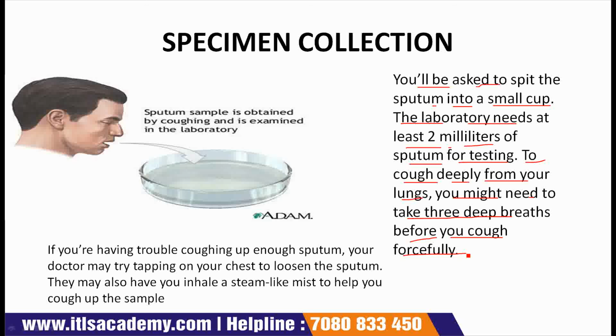Your doctor may ask you to rinse out your mouth with clear water to help get rid of any other bacteria and extra saliva. If you are having trouble coughing up enough sputum, your doctor may try tapping on your chest to loosen the sputum. They may also have you inhale a steam-like mist to help you cough up the sample.